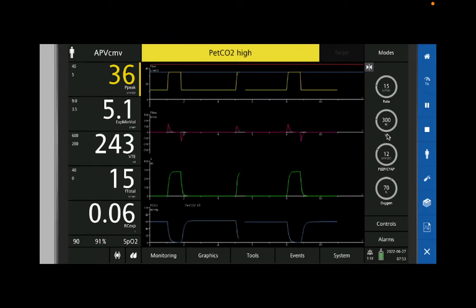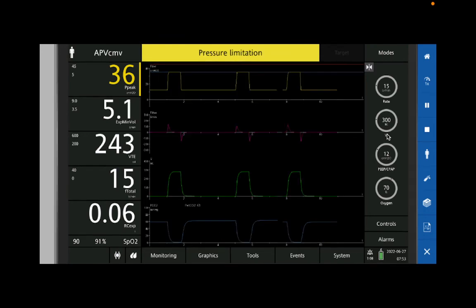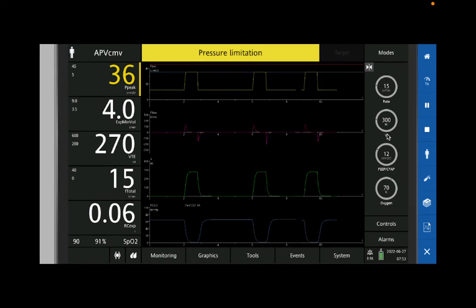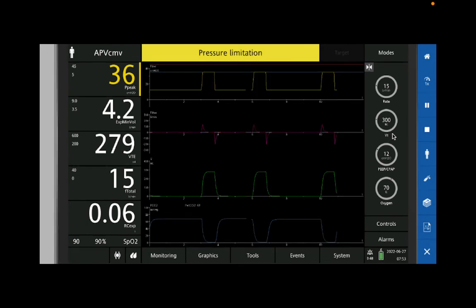What do we need to watch as we increase our PEEP? Your blood pressure, right? So we do a blood pressure. He's on norepi. It is 95 on 50. Are you okay? I am. Yeah, that's fine. It's not great, but we're broken on multiple sides.